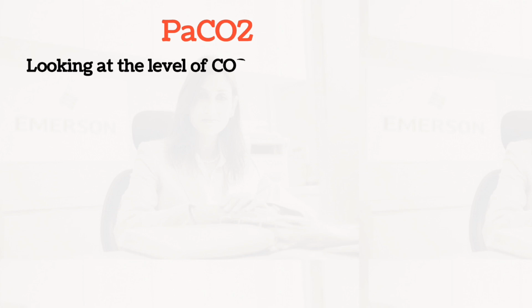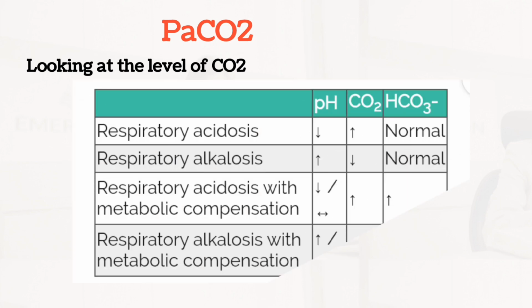At this point, prior to assessing the CO2, you already know the pH and the PaO2. So for example, you may know your patient's pH is abnormal but you don't yet know the underlying cause. It could be caused by the respiratory system, abnormal level of CO2, or it could be metabolically driven, abnormal level of HCO3. Looking at the level of CO2 quickly helps rule in or out the respiratory system as the cause for the derangement in pH. Let us now look at the table.